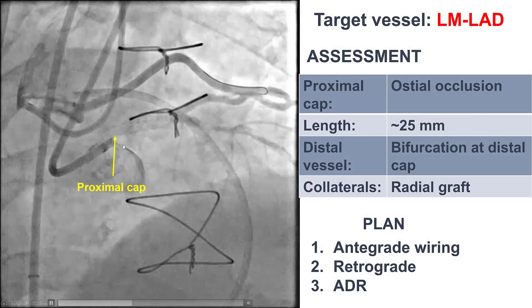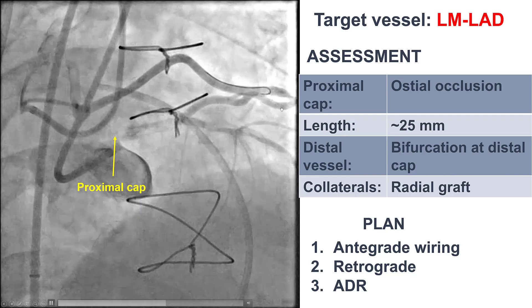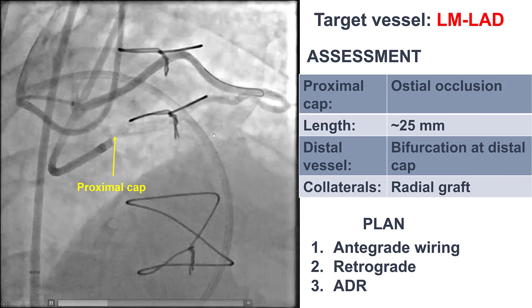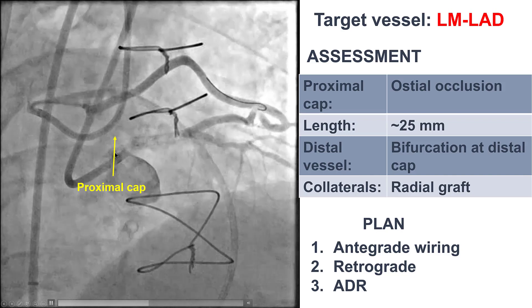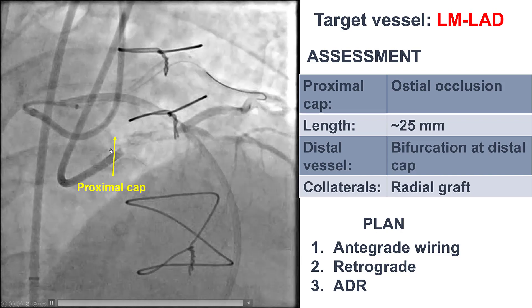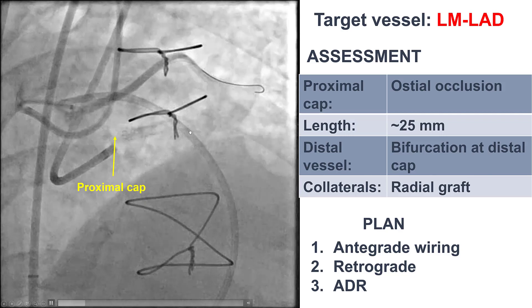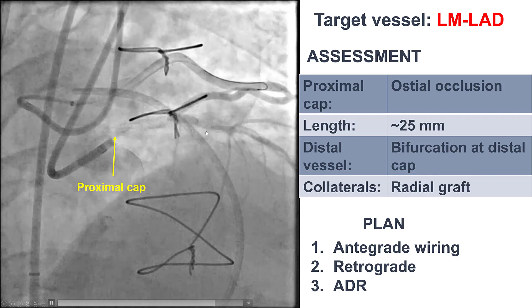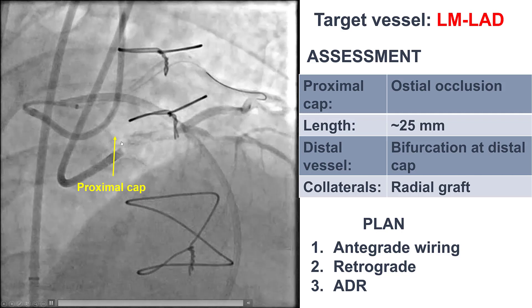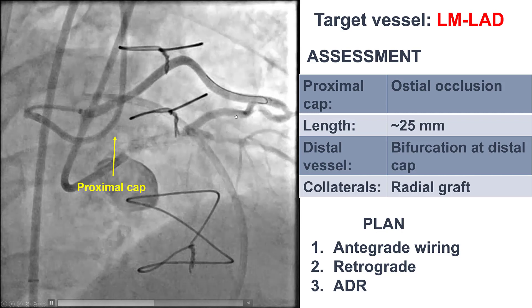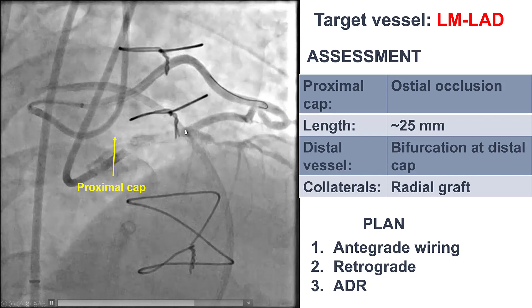The patient was referred for PCI of the left main CTO because it was considered extremely challenging to deliver equipment through these two 180-degree bends. The proximal cap is slightly ambiguous — we can kind of assess where the left main was originating. There is some calcification, but we do not have a very clear proximal cap. The length is about 25 millimeters. There is a bifurcation on the distal cap where the diagonal takes off from the LAD, and there is the radial graft supplying the diagonal branch. Our plan was to try antegrade wiring first. If it didn't work, try retrograde crossing. And if that did not work, try ADR — which was the least preferred approach because of the bifurcation of the distal cap.